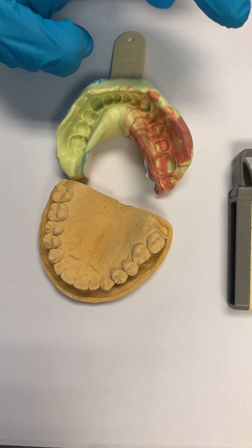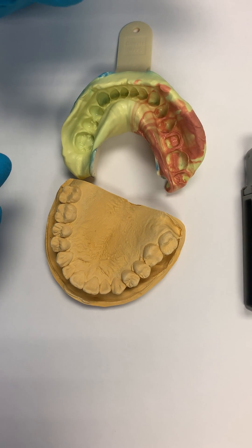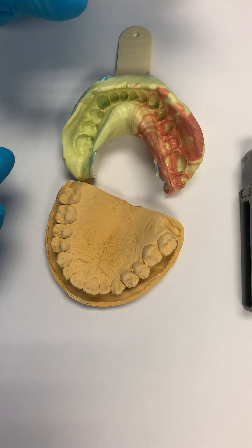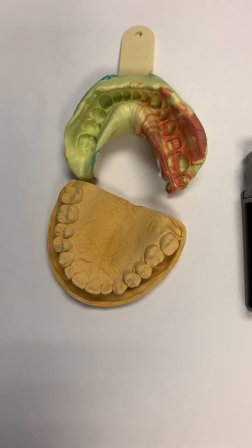With a full arch mounting, I can match the right and left side and work with lateral and medial excursions. In that sense, it provides much better occlusal stability and therefore better crown fabrication. Hope that answers the question.